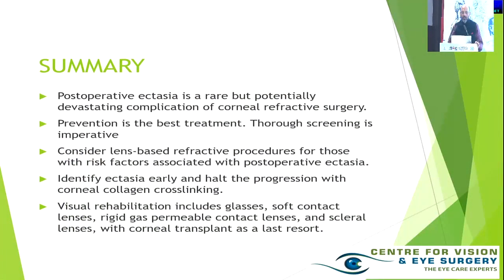In summary, post-operative ectasia, though rare, is a potentially devastating complication of corneal refractive surgery. Prevention is the best management, though screening is imperative. Consider lens-based refractive surgeries for those with risk factors associated with post-operative ectasia. Identify ectasia early, halt the progression with corneal collagen cross-linking. This probably would be the baseline before you attempt to do anything else.